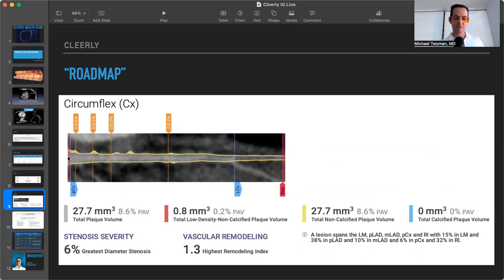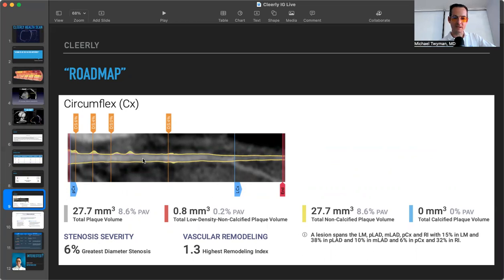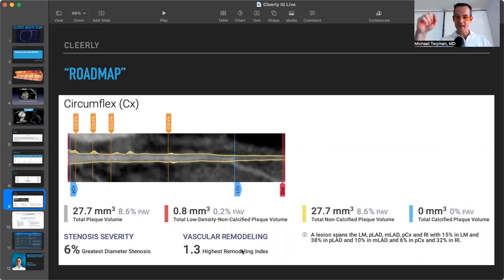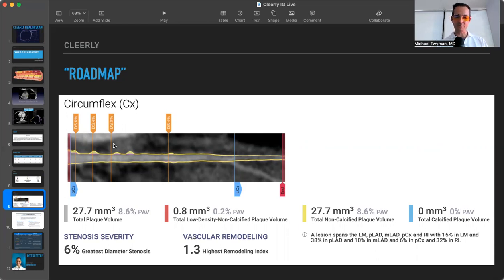So this is the circumflex artery, and in the middle is where the contrast or radioopaque material is flowing. So it lights up the inner lumen of the artery, and then the little yellow bumps, this is where the plaque is. And in this individual, the plaque is mostly positively remodeling. So the artery grows outward first and is not necessarily encroaching into the lumen. So you're not expecting this person to have any symptoms from this plaque.